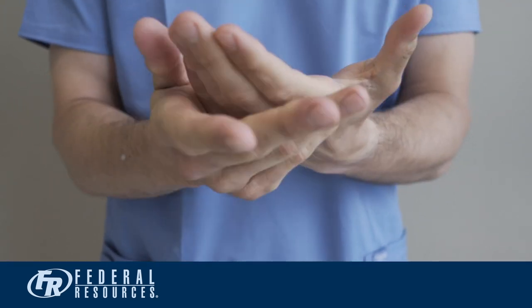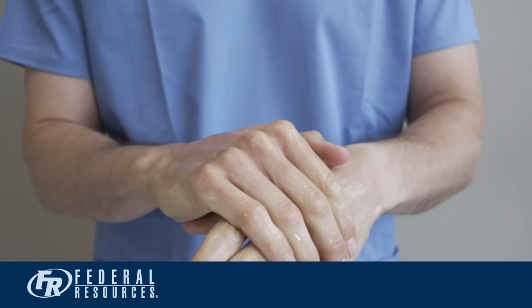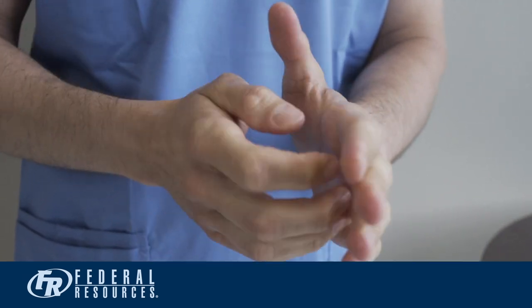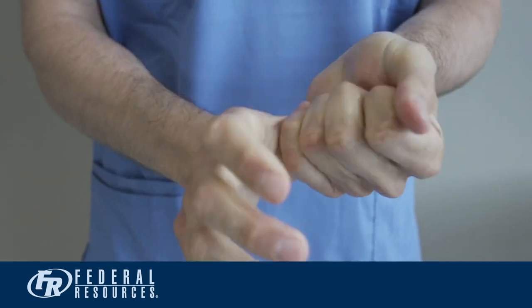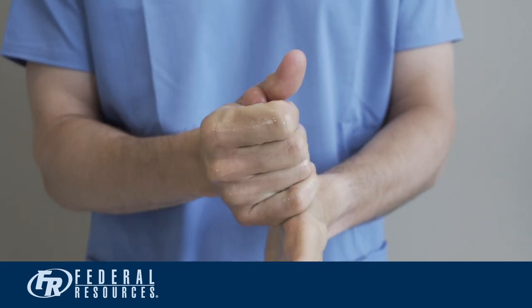Start by rubbing the front of the hands and the back. Get really good contact between the two palms. Move to the back of the hand and get in between the fingers, down to the web spaces. Do thumbs individually by wrapping the thumb with the opposite palm. Finish up by continuing to rub hands together until they are dry.